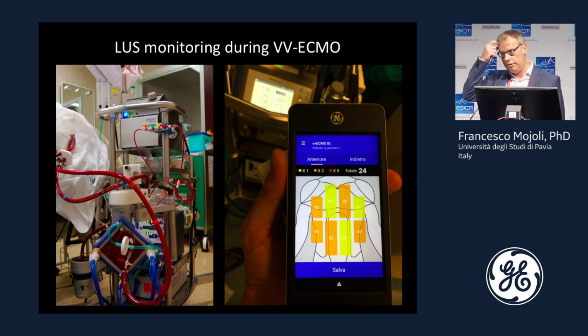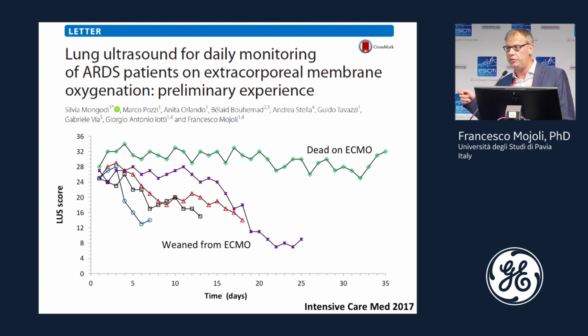There are many practical uses for this monitoring tool. For instance, in our unit, we perform a daily ultrasound assessment in ARDS patients, especially in those patients under VV ECMO. And this is from our initial experience. You see how the patient who died on ECMO had a completely different trajectory compared to those patients we were able to wean from the extracorporeal support.